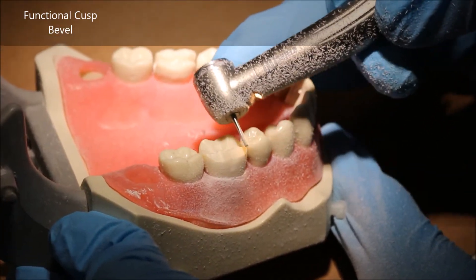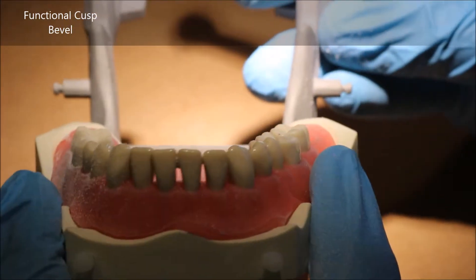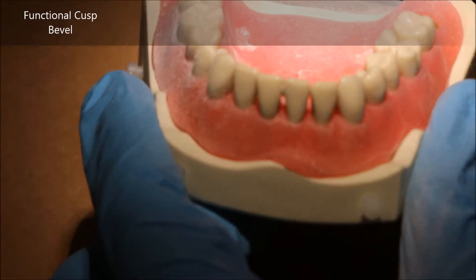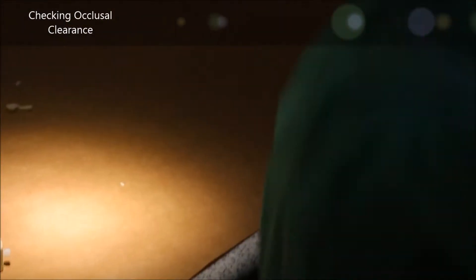What I'm doing here is placing the functional cusp bevel. The functional cusp bevel replicates the bevel on the buccal cusps of the mandibular teeth and the lingual cusps of the maxillary teeth. By placing the functional cusp bevel, you will see how much occlusal clearance you really have, and you ensure that the cusp tips are in line with all the other adjacent teeth.